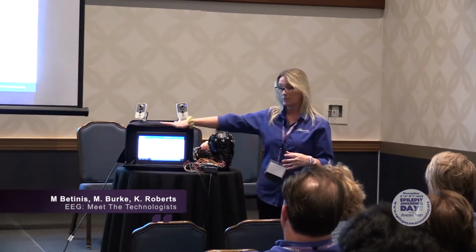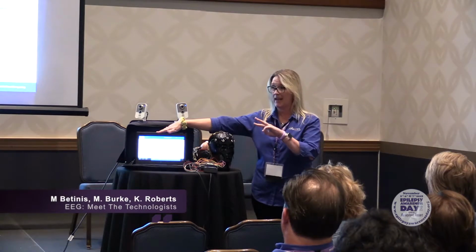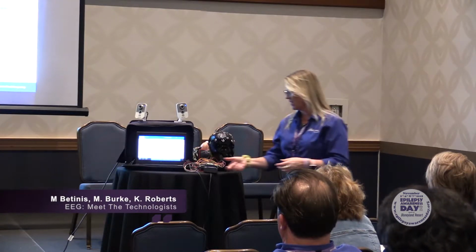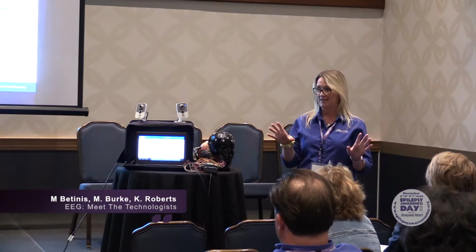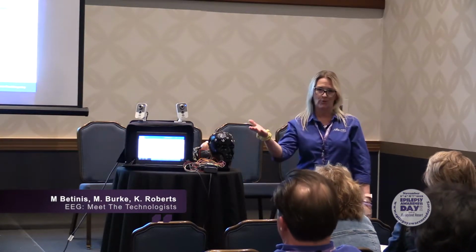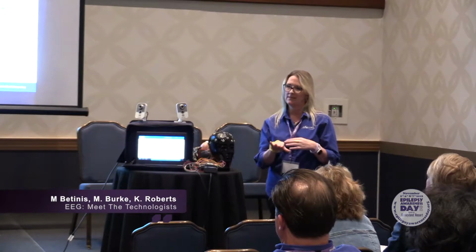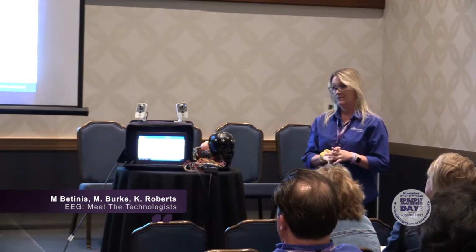Because we want this recording to be really good for 24 hours. We don't want it to be on there for 3 days, and in one day, half of them fell off, and no one knew. Or the plug came out, or the battery, whatever the case may be, it's all happened. Then you come back and say, oh, sorry, we have to repeat that for 3 days on your 2-year-old. So this is a really good cost-effective measure with the cloud now. And there are other ways to log into the system as well, but that's pretty cutting edge.